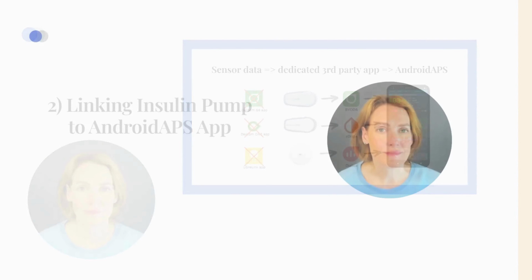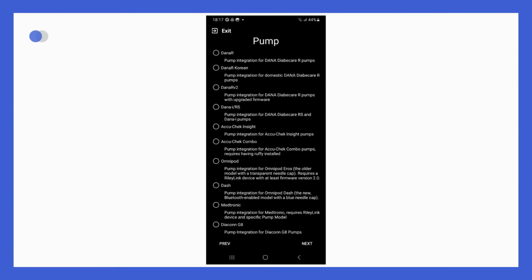2. Linking the insulin pump to the AndroidAPS app. When using the AndroidAPS app, you will have the option to link it to your insulin pump. Upon launching the app, you will be prompted to select the type of pump you are using.